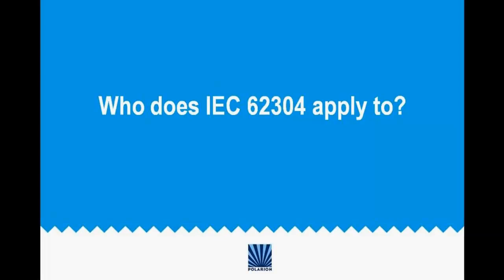Okay, great. Let's move on to the next topic, and in fact there's a good question from the audience that kind of applies to this. So first, the topic is, who does IEC 62304 apply to? And the question that came from our attendees is, does the FDA and EC require companies to follow IEC 62304, or is it optional? It's optional in the sense that you don't have to follow it.